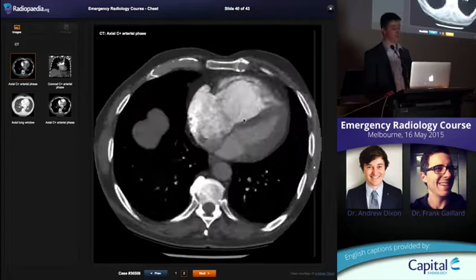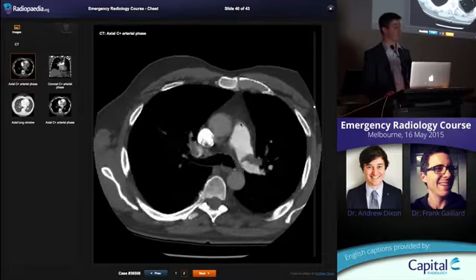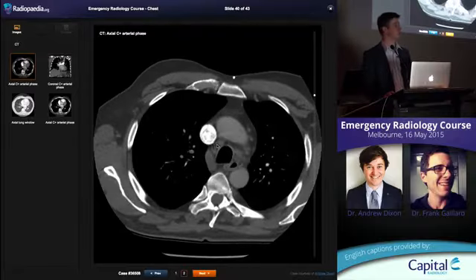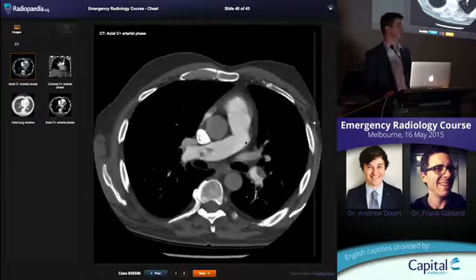So again, a good ED physician is going to be one who can use an ultrasound probe. And so if you've got a patient who you think's unstable, might have a big PE, let's have a quick look at the heart. Is the right heart dilated? If yes, I don't necessarily need the scan to know that they've got a big pulmonary embolus.